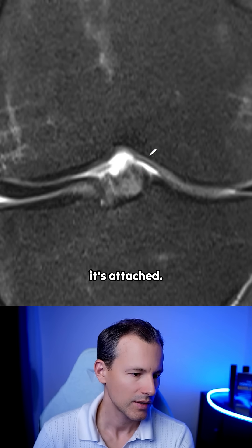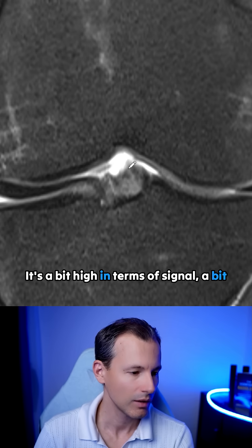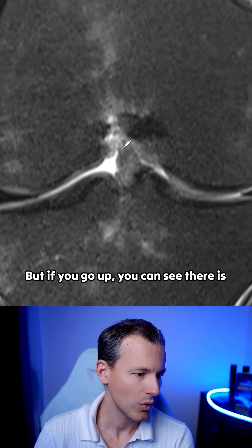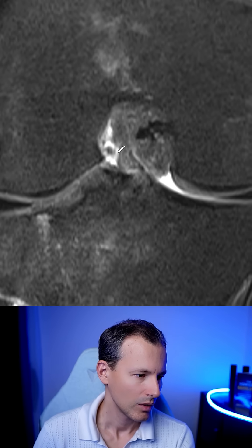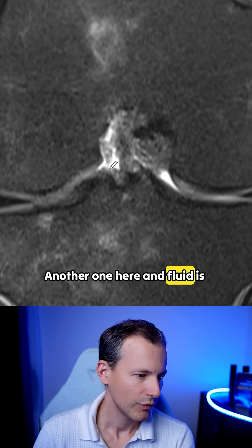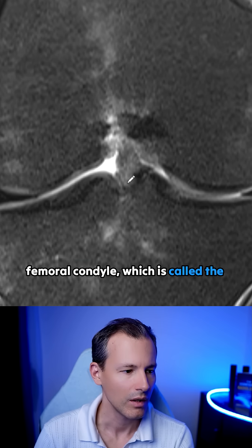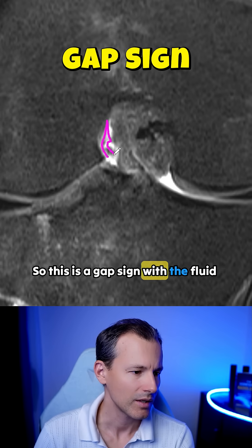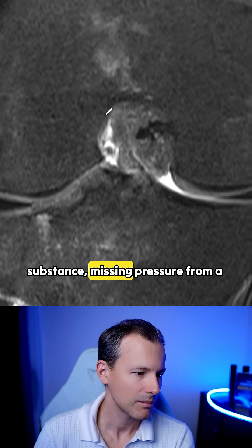Here you scroll through and you can see the insertion distally — it's attached, it's a bit high in terms of signal, a little bit of scarring and granulation tissue. But if you go up, you can see there is this flap here hanging down, not going anywhere — another one here. And fluid is tracing along the inner aspect of the lateral femoral condyle, which is called the gap sign.